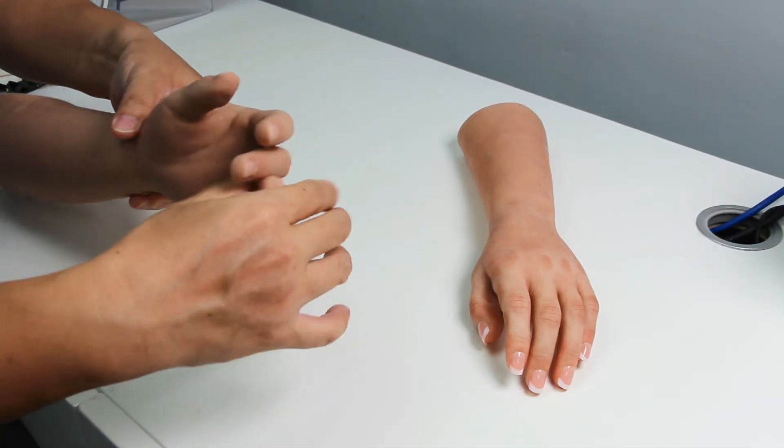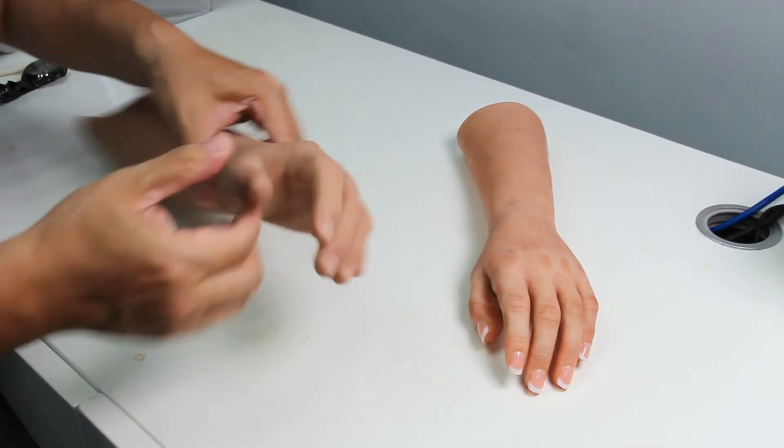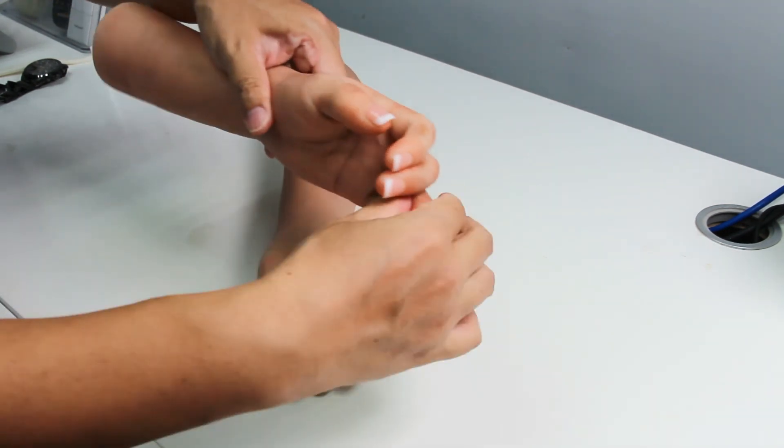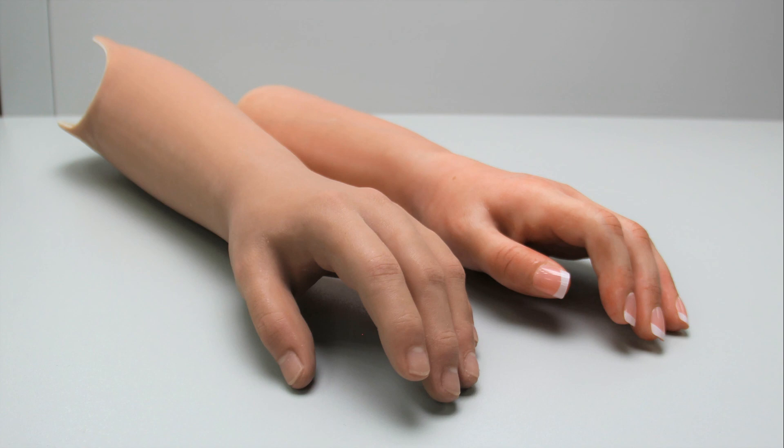Wired fingers allow the patient to bend the fingers. Hinged fingers can be bent at a more precise angle. Both wired fingers and hinged fingers are for cosmetic purposes and are not supposed to be functional.